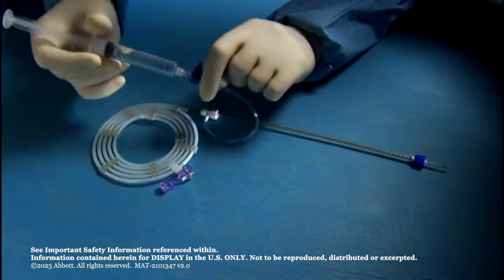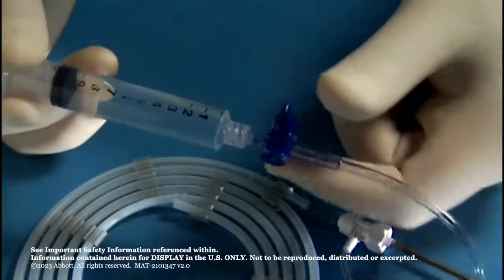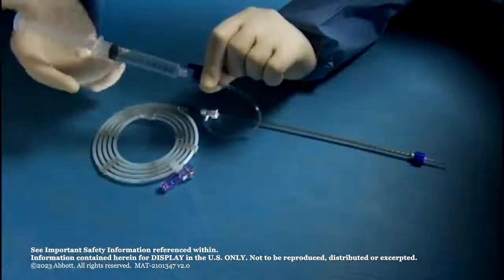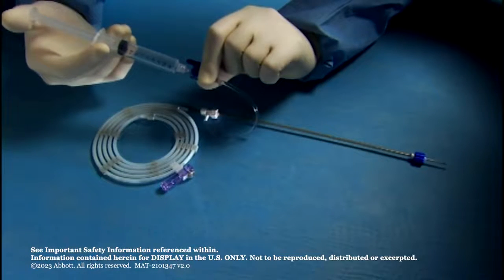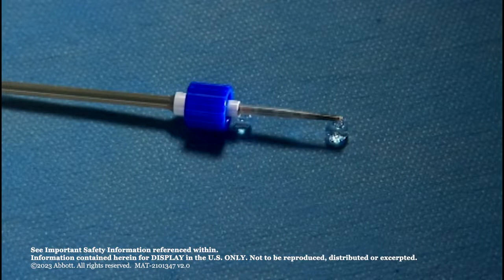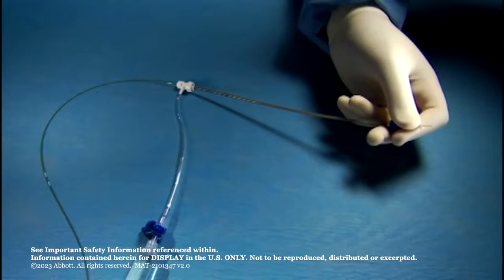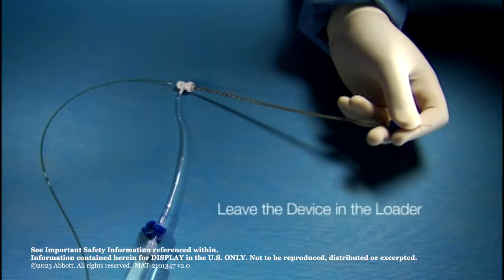Connect a 10 cc syringe of sterile saline to the stopcock and flush the loader and device until sterile saline exits the distal tip of the loader through the device. Do not advance or retract the device from the loader without attaching the loader to a catheter hub. Leave the device in the loader.